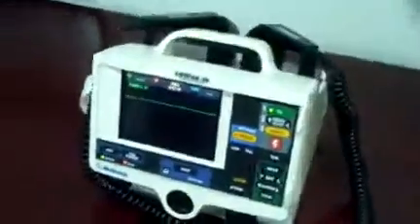Hey, it's DCSP Medical. Today we're looking at a Medtronic Physio-Control LifePak 20 defibrillator. Power's on, and there is a service light on.